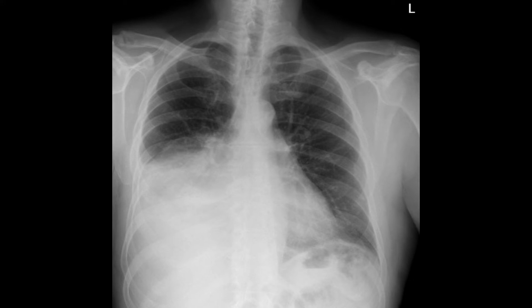The trachea is shifted to the left. The costophrenic and cardiophrenic angle of the right lung is obliterated. The upper margin is concave. The rest of the lung fields are normal.